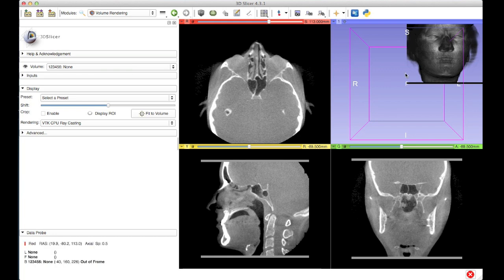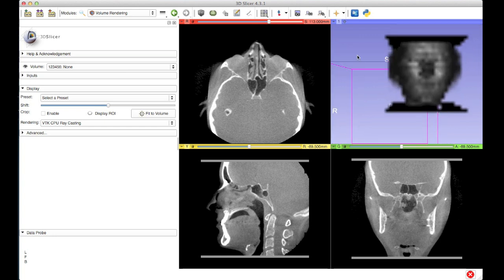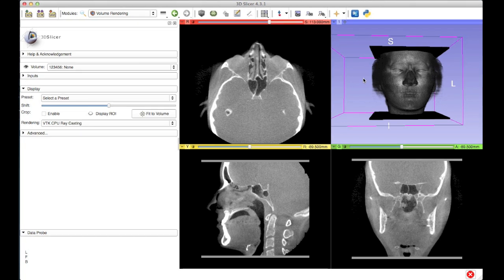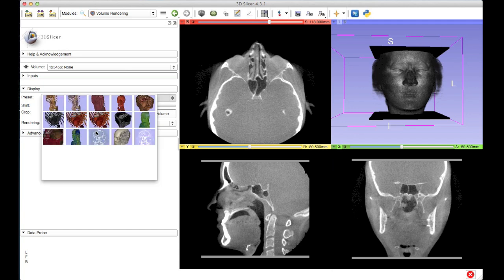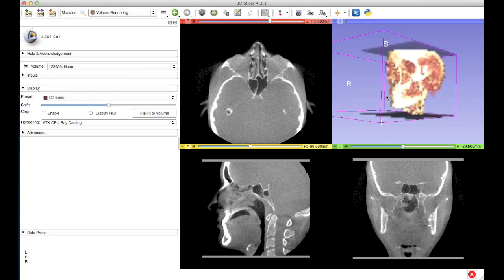I'm going to use shift, click, and drag to pan this rendering in space, just as I would in the slice views. I'll use this icon in the top left, which looks like a coordinate system, to center my scene view onto my volume rendering. What will really be useful to me is to see the bones in my volume rendering, because I'm trying to model the TMJ. So I'm going to use one of these presets listed in the menu, which are specifically thresholded and colorized to help you visualize different aspects of your data. I'm going to pick this one called CT bone, and when I do that you can see the bones in the cone beam CT volume rendering.